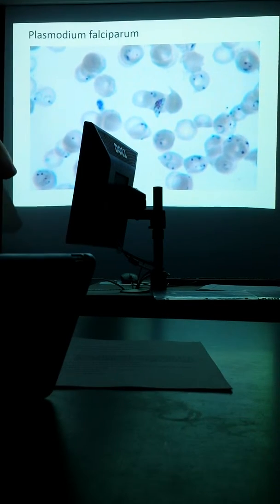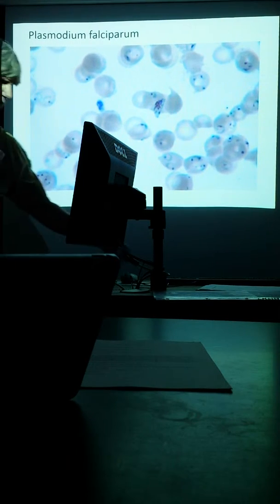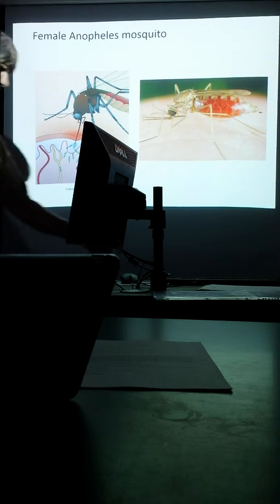All right, now for malaria, what we see are the merozoites now inside of the red cells. And again, red cells don't have a nucleus, so anytime you see a staining structure inside of there, you have something wrong. So anyway, again, you see on the inside now of the cells for the Plasmodium, female Anopheles mosquito, and remember for the 100th time, female and Anopheles and mosquito for our ID here on the vector.